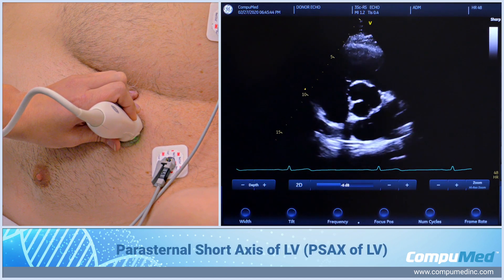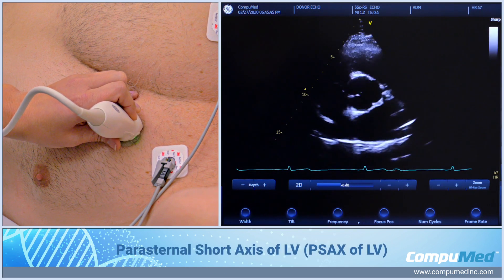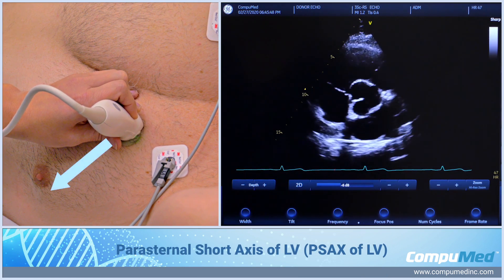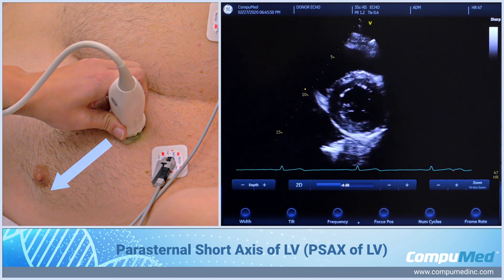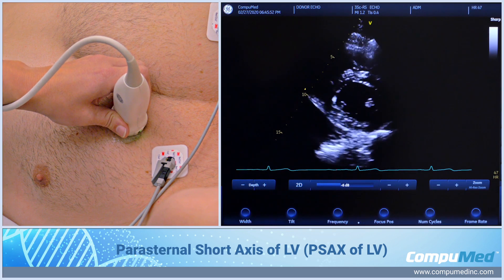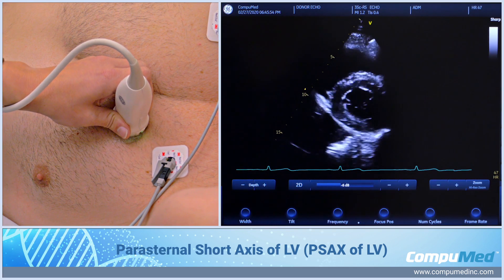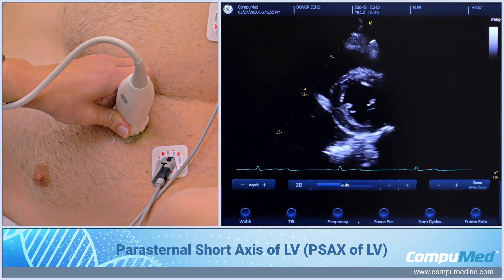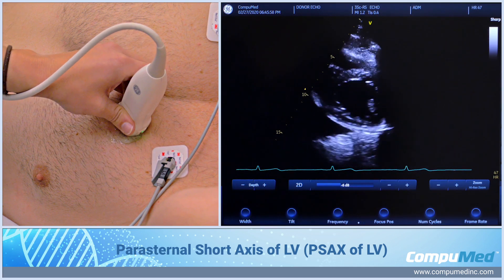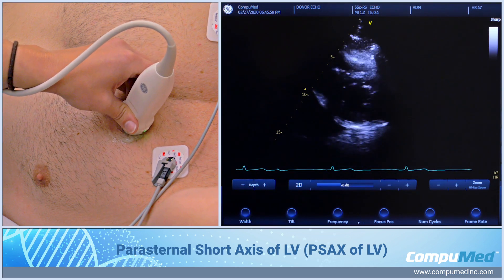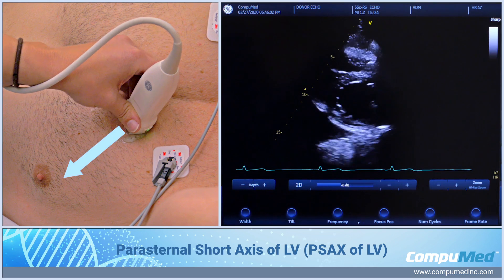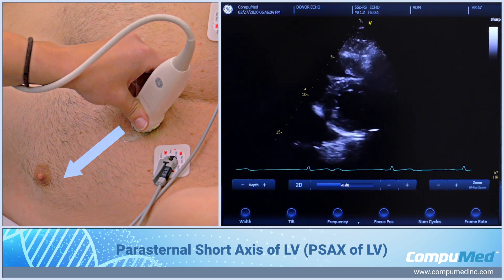From here, to get the short axis of the left ventricle, I'm going to angle the transducer inferior, keeping the location of the transducer in the same place. I'm going to continue to go down so that I get base, papillary muscle, mid, and then apex.